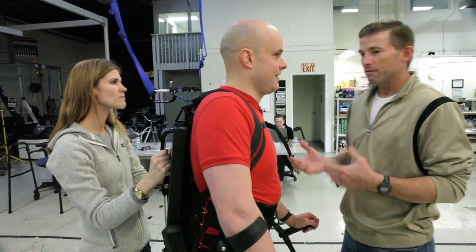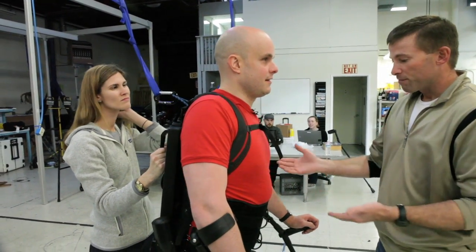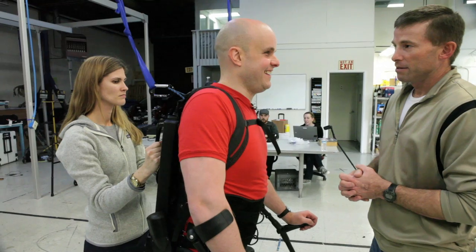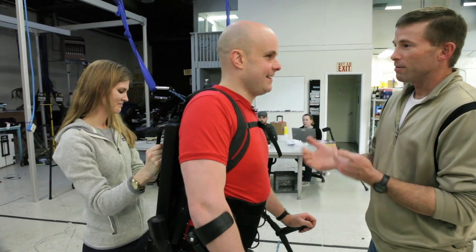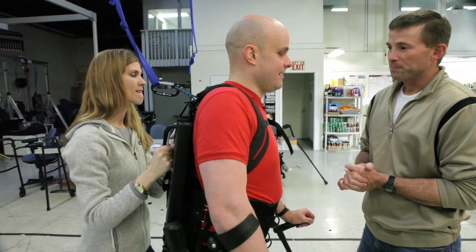No other device out there that I'm aware of — and I've been doing spinal cord for about 20 years — gets to walk 400 feet and get to crutches in their first 30 minutes. So just think about what you're learning and how there's a reason this is hard. We're asking a lot. Okay. Thank you, Juan. Thank you everyone.